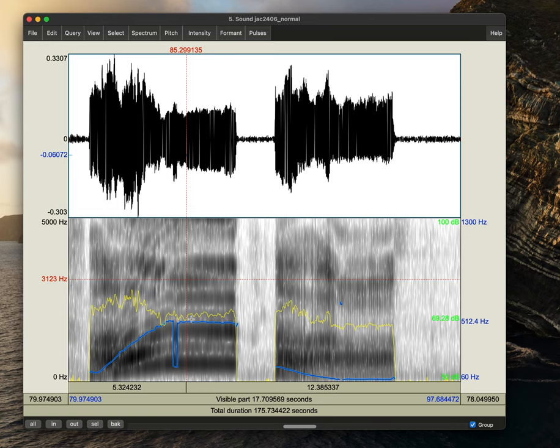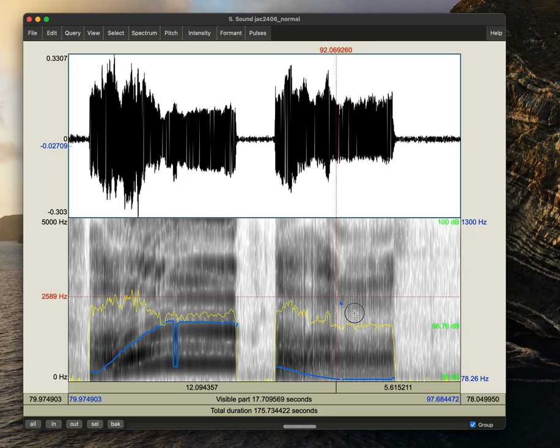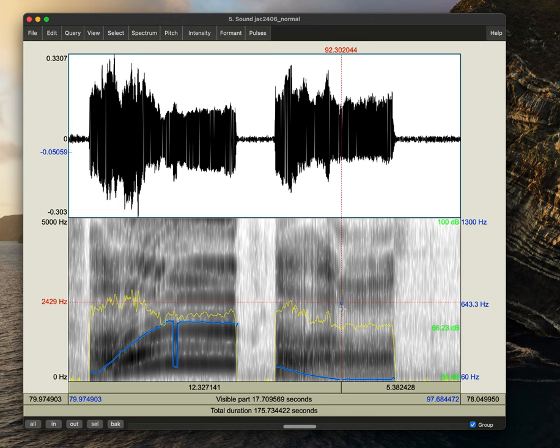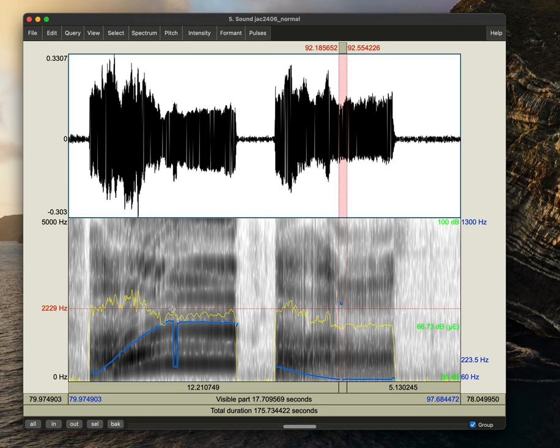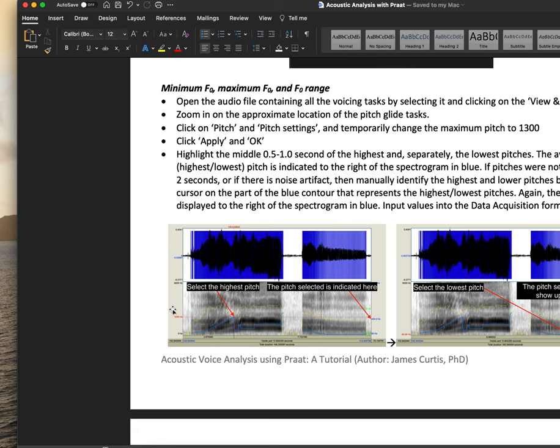And we can see now that the pitch range was in fact changed to 1300. This didn't affect us too much because I am not going up to 1300 Hertz. You'll also notice, however, that with this increased range, we do get a kind of noise artifact in this region here, which we don't want to measure. And this is why we set the pitch settings normally to a speaking range of 60 to 800 Hertz to avoid noise artifact like that as much as possible.